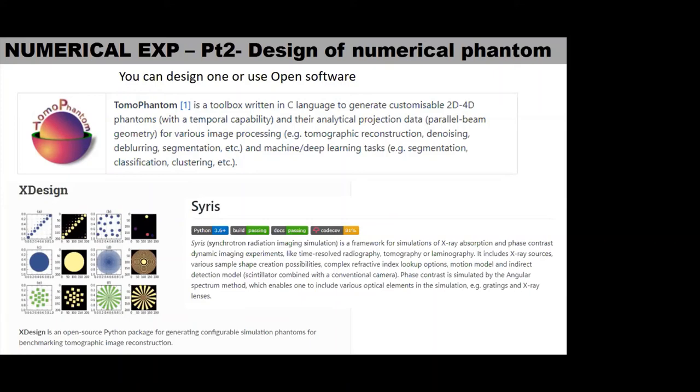So they give the contrast and then they take the CT. And instead of taking two different CTs, they take just one CT and separate what the normal without contrast will be from what with contrast will be in just one shot, to reduce the scanning time as well as the dose to the patient. So, however, there is one comment you mentioned that I would like to address.